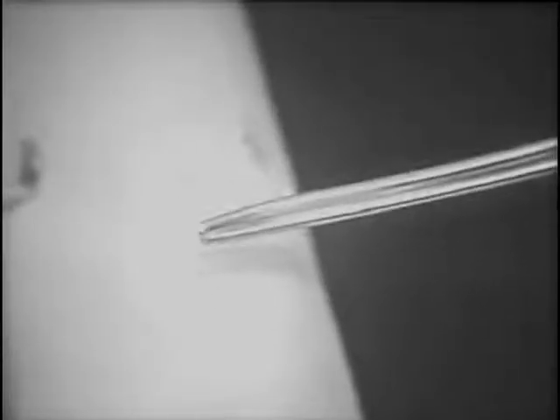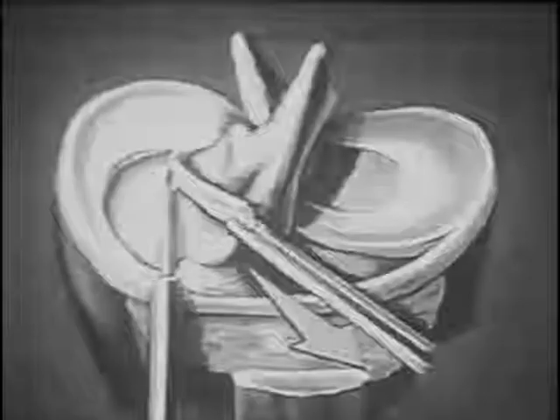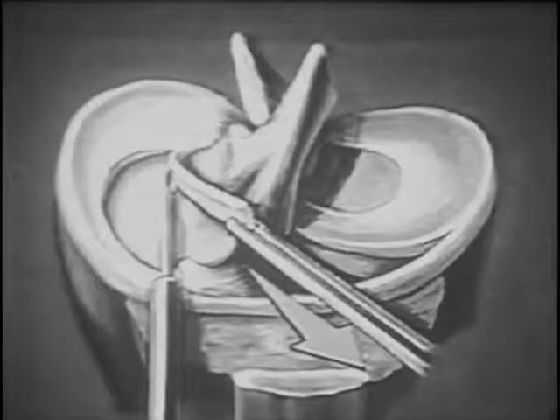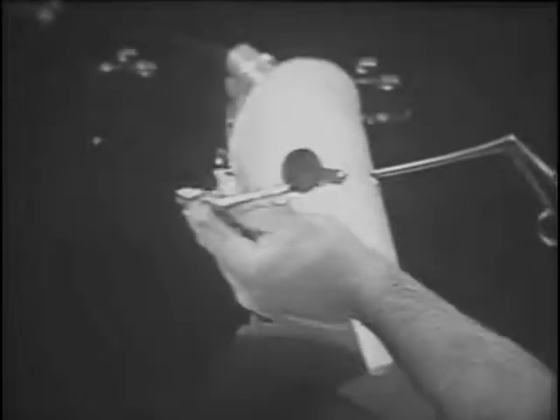Johnson jaws is inserted through the lateral portal. The diagnostic scope remains in the medial joint. The Johnson jaws is used to retract the horn laterally. As this is firmly grasped, a towel clip on the handles keeps it in place.